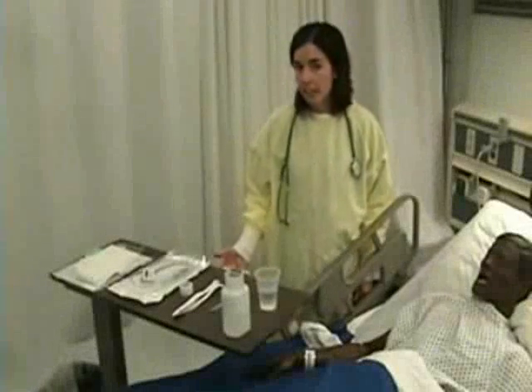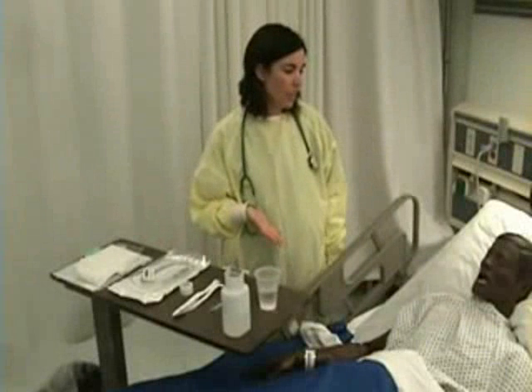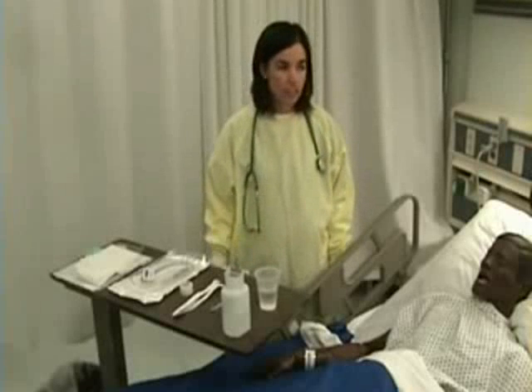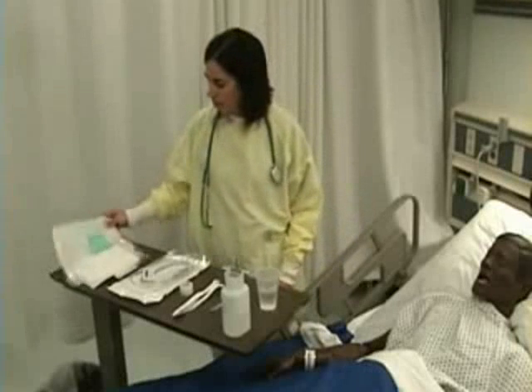To begin, I need to have an order to place an NG tube. I will say today that my patient has difficulty swallowing and weight loss and is going to have an NG tube for medications and feedings. I will begin by checking my order.